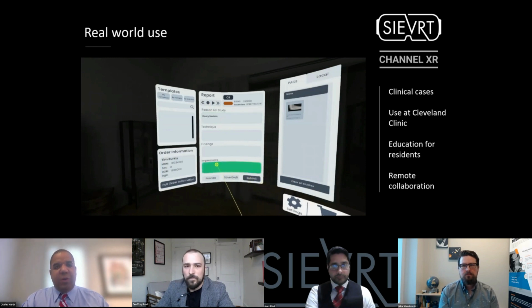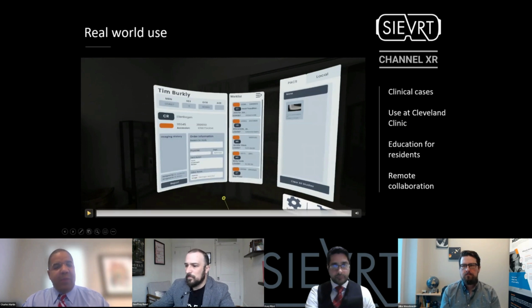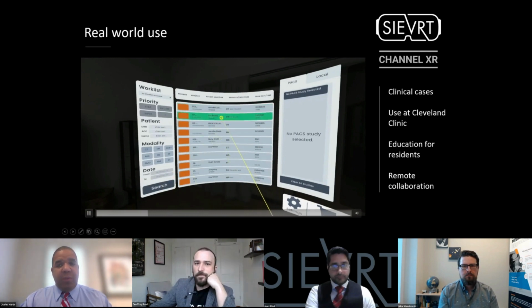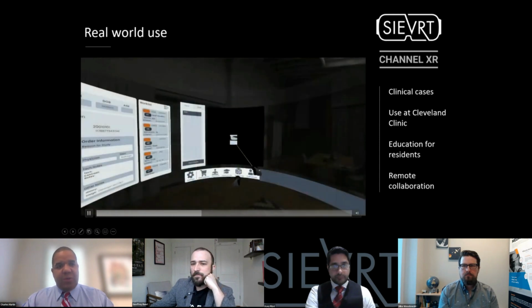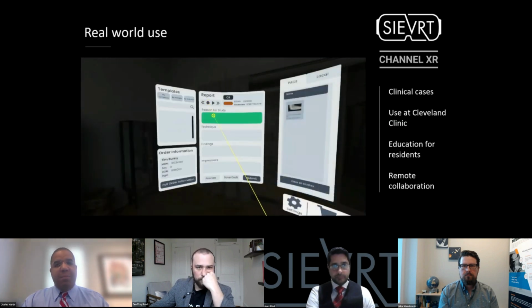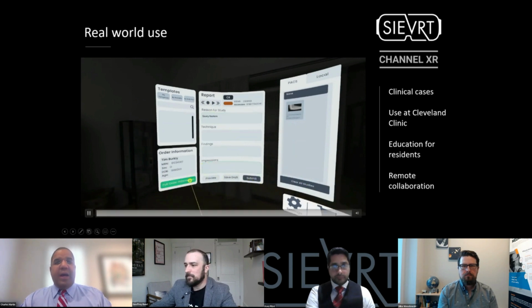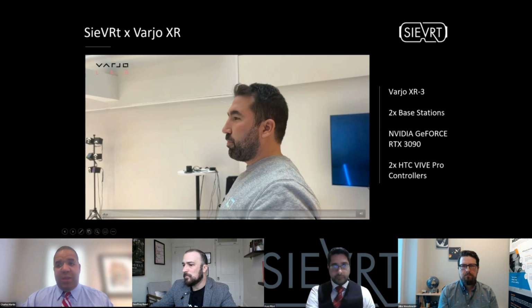Essentially, when you step inside a radiology reading room, we have multiple monitors. It's not just, let's say, one laptop. It's typically anywhere from 3 or 4 different screens, if not more. We're working with multiple pieces of software, bringing in MR, CT, ultrasound, and using that information in addition to the electronic medical record to correlate multiple pieces of data to provide the most comprehensive report that we can. In the midst of that, we're working and engaging with residents.